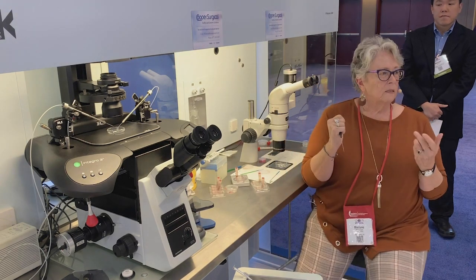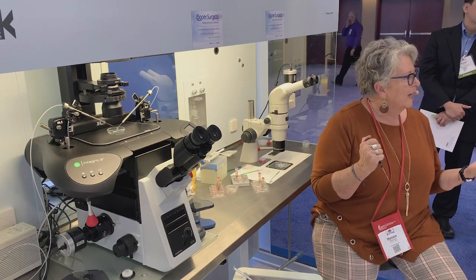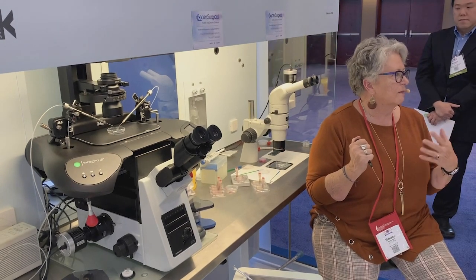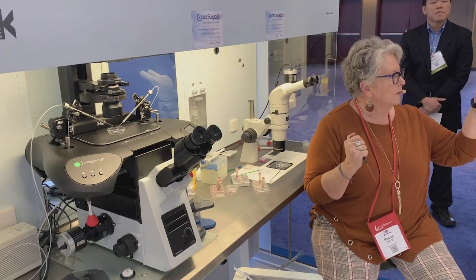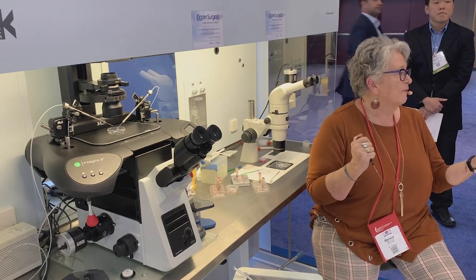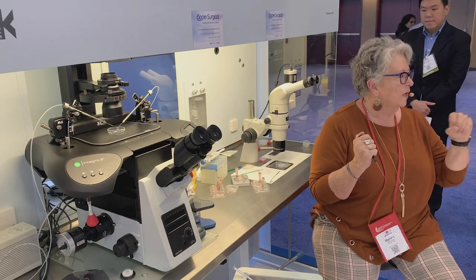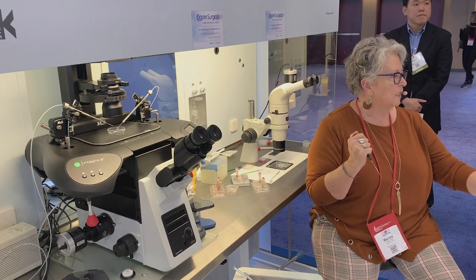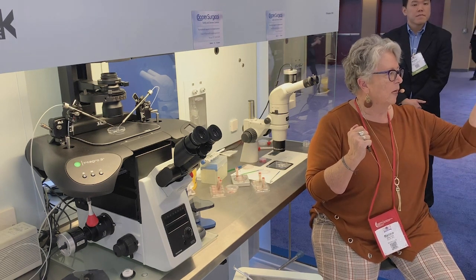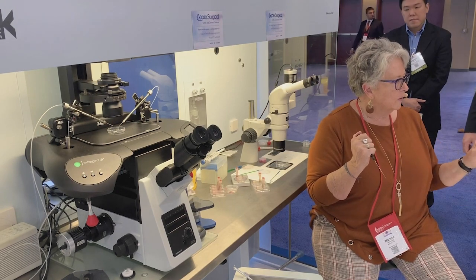Now, obviously, the thing our beads are not going to do is float. Everyone who's ever done vitrification knows the first thing you have to wrestle with is that your embryo floats and you have to be able to follow it, which is why I say don't have a tight focus. You want to be relatively far back. So when you put that embryo into the dish, you can watch it float and settle back down. So you keep an eye on your embryo.